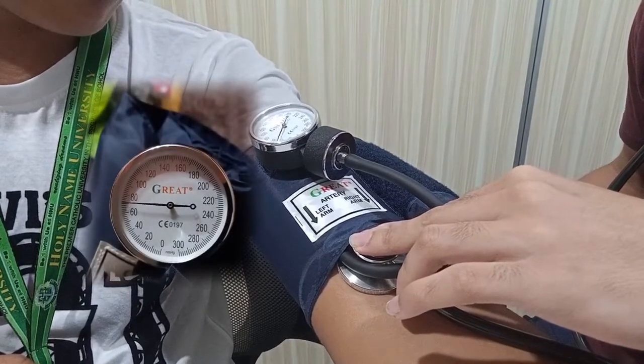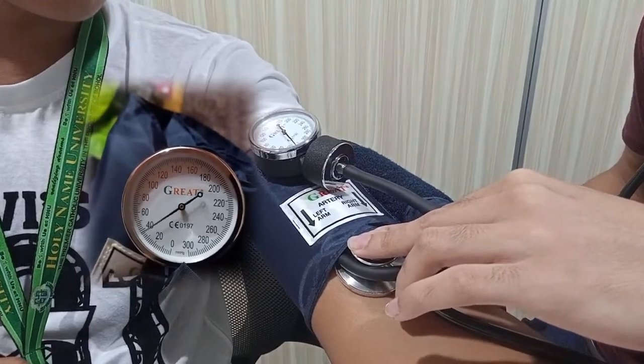Lastly, allow the cuff to completely deflate. Measuring your blood pressure, along with the terms that come with it, is something one must know if you wish to evaluate your health condition.